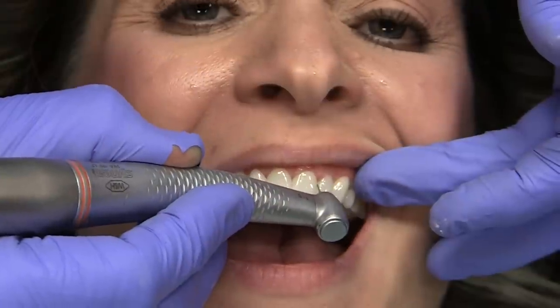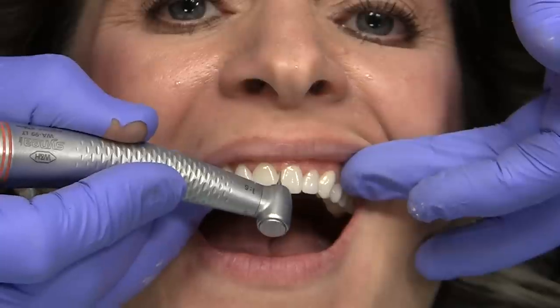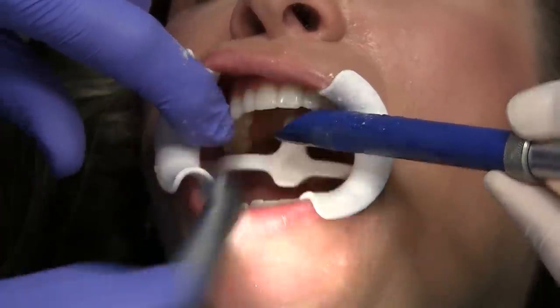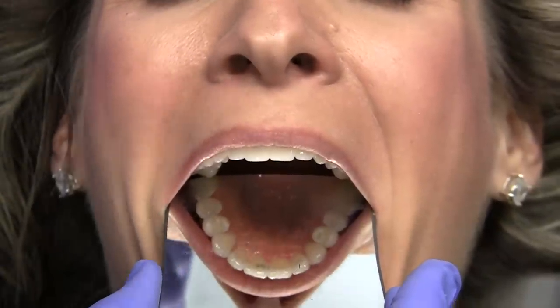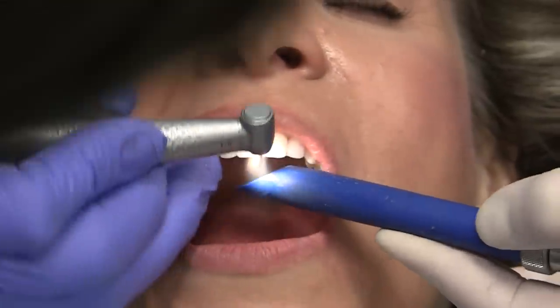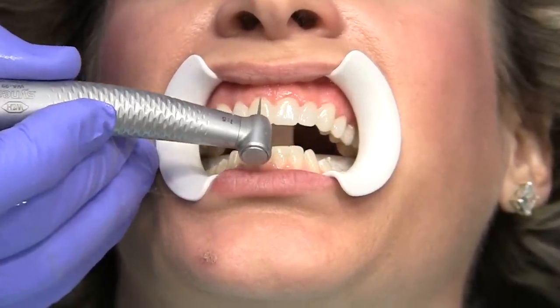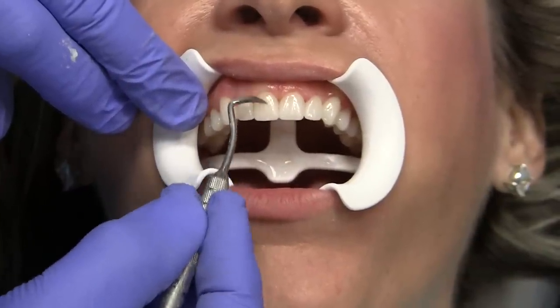Using a Mosquito Interproximal Diamond, remove any existing porcelain ledge and refine the margins along the inner proximal area if necessary. Continue using the Mosquito Interproximal Diamond to further polish the margins if needed. Check the bite with articulating paper. Use the football diamond on the lingual to finish the incisal wrap and adjust high spots or length. Trim or polish the margins of the porcelain veneer if necessary and use an extra fine smoothing diamond to smooth out the porcelain. Explore the tooth structure next to the Lumineers to check the margins; there should not be a catch or bump.